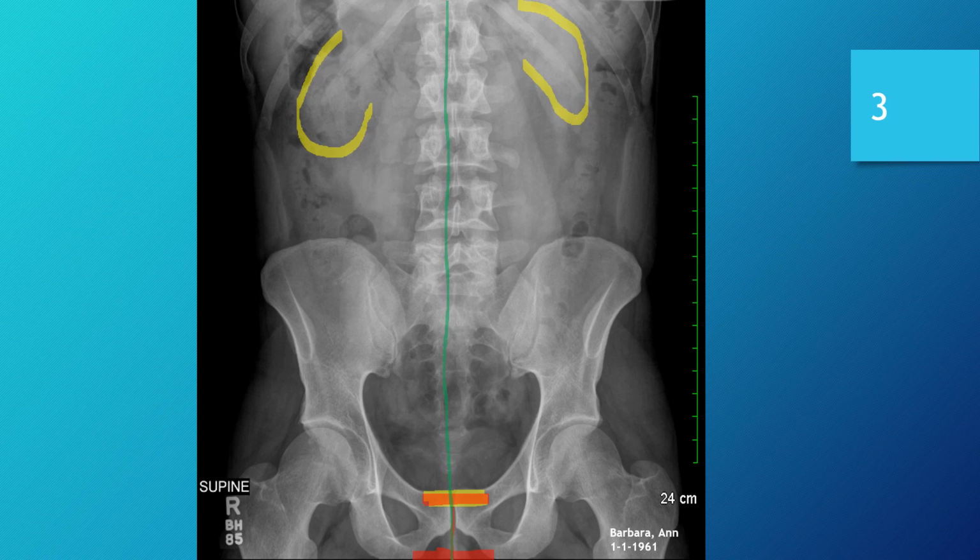and let's see. Okay, so we have our lines up. From a mid-sagittal sense, the image is very well positioned. It's pretty much dead on for mid-sagittal alignment to the IR. So very good positioning there. However, after drawing my line, as you can see, it certainly does appear that the patient was originally positioned a bit low.